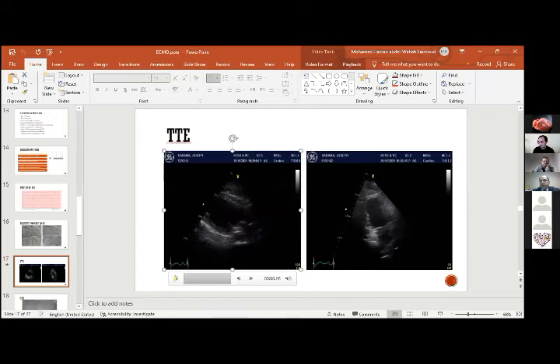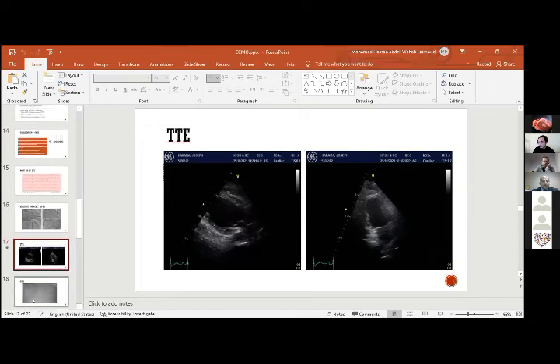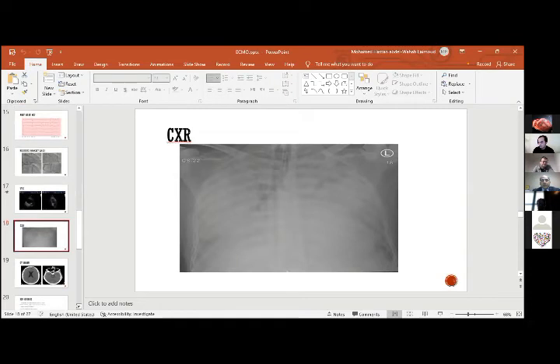Echocardiography was done: normal sized heart, but ejection fraction less than 10%. The patient was hypotensive in the cath lab despite high doses of inotropes. He was severely hypoxic despite ventilation. X-ray showed bilateral white lungs. He was in cardiogenic shock with frank pulmonary edema. The decision was taken in the cath lab to go for venous arterial ECMO support.